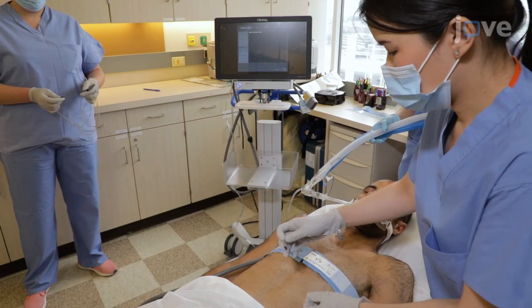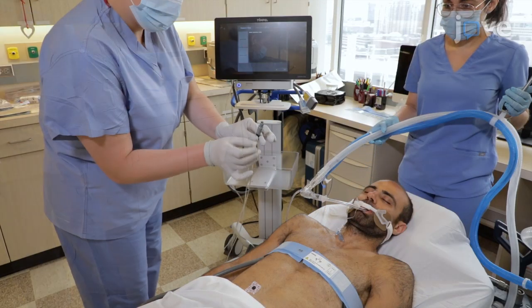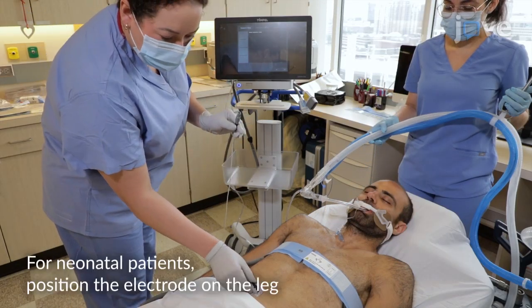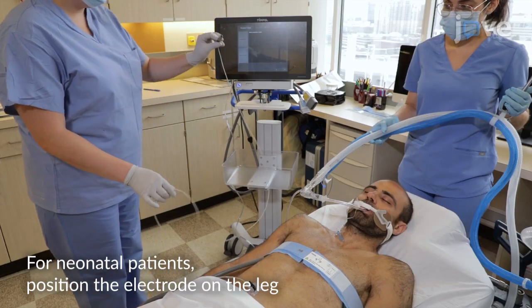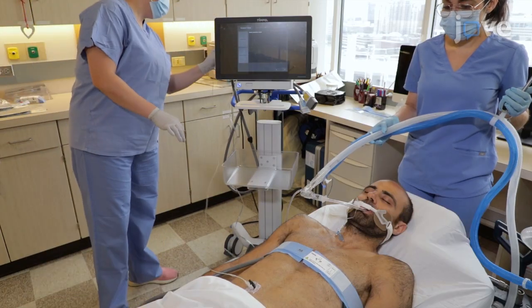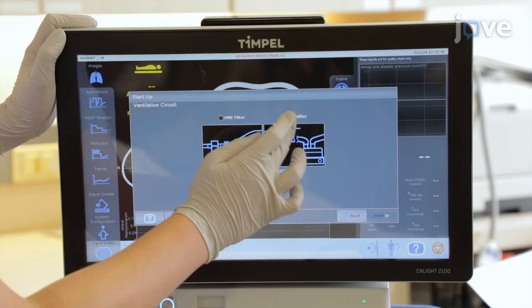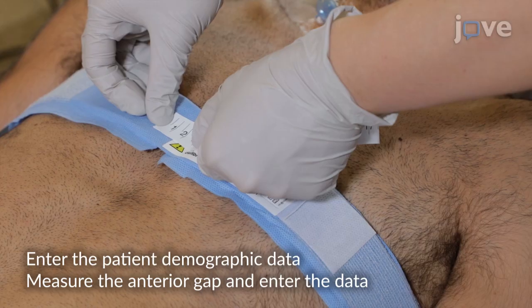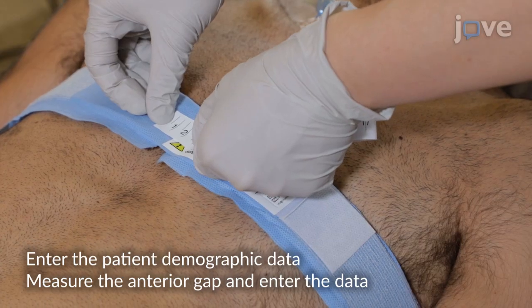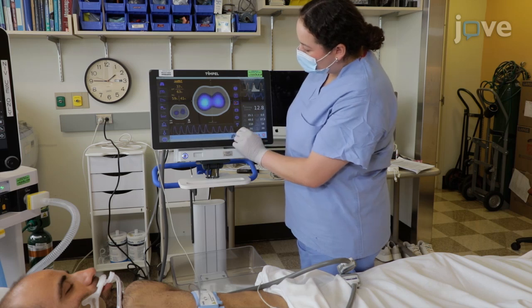Connect the belt to the EIT device. Next, connect the reference electrode to an electrocardiographic or ECG electrode. For both adult and pediatric patients, position the electrode on the abdomen or shoulder. Turn on the electrical impedance tomography or EIT and enter patient demographic data. Then, measure the anterior gap and fill in the results.